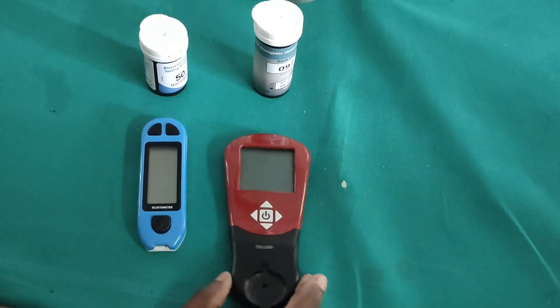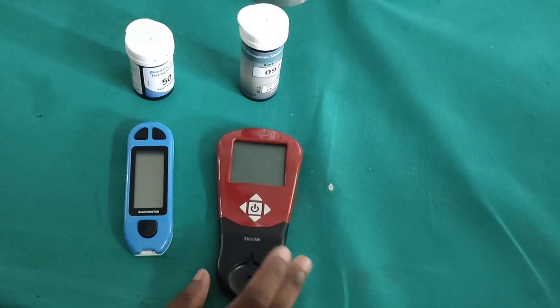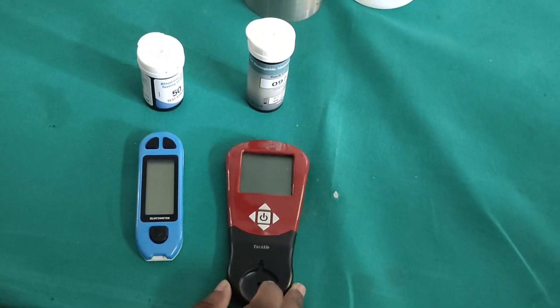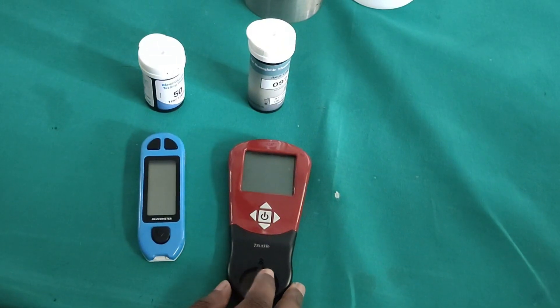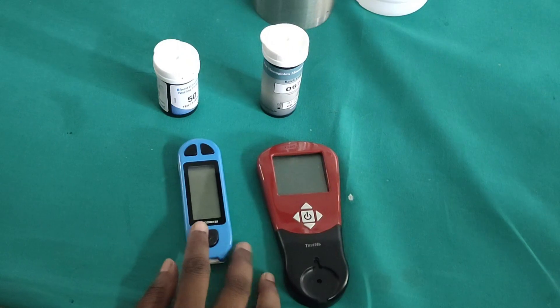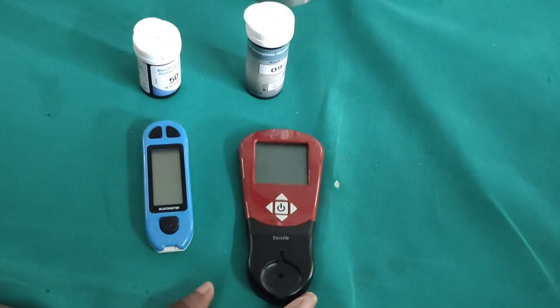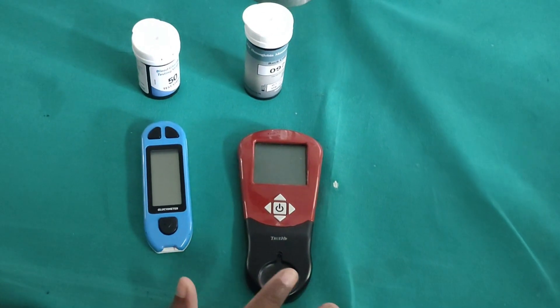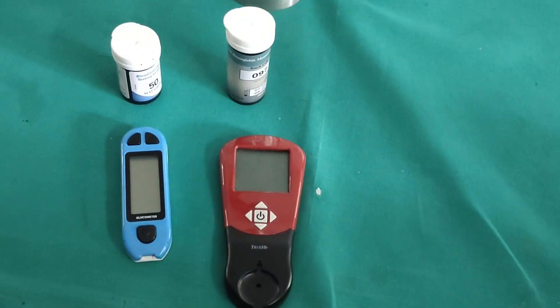A patient came in with generalized weakness, so I am going to test him using the true HB meter for hemoglobin and for RBS I am going to use this glucometer. A patient cannot be diagnosed without these tests, so we have to test for HB and RBS.